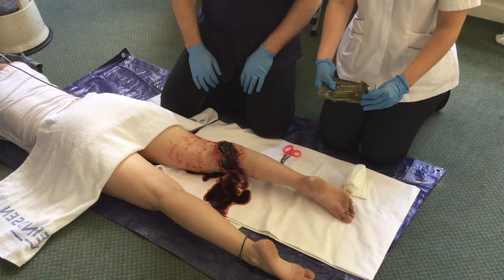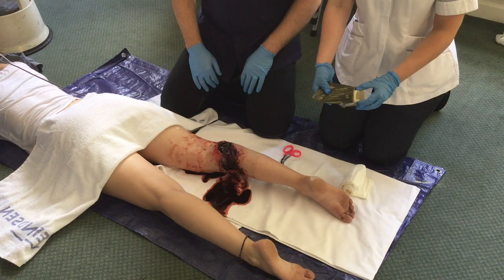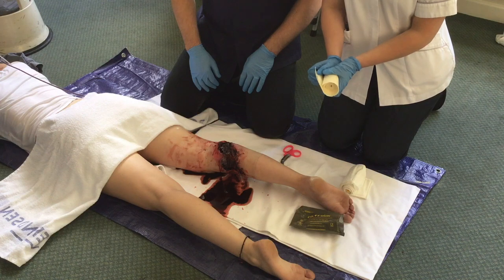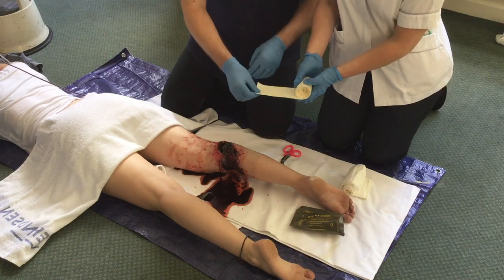The first operator removes the roll of Seelox gauze from the packet. This is kept in a rolled up position and a working end is passed to the primary operator.